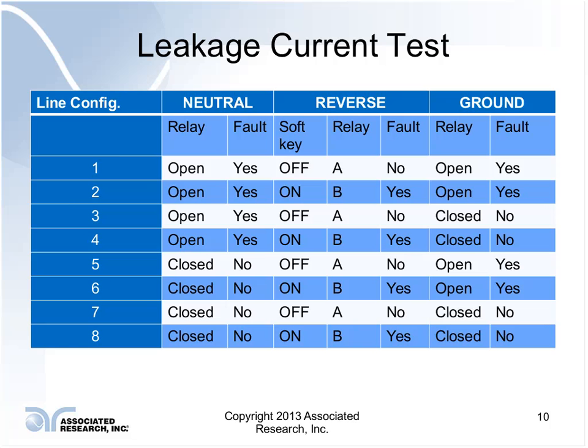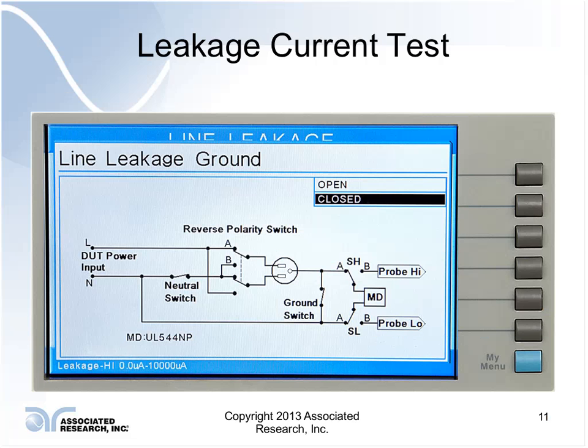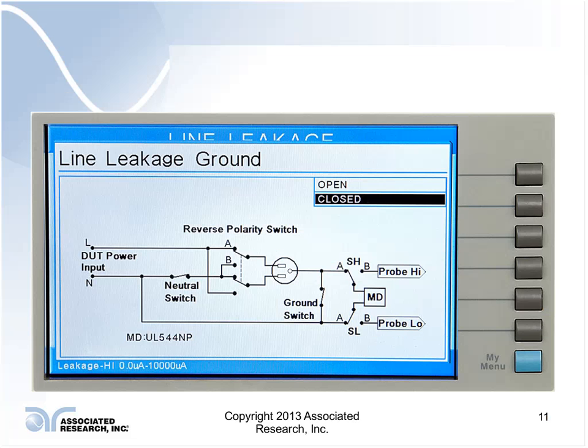It can't hurt to cover your bases, and if you do all 8 of these tests for every leakage test, you're pretty much covering your bases. You're going above and beyond what you need to do, which is never a bad thing. But you might see certain setups, certain labs, or customers test them with slightly less conditions, and that's okay, just as long as the main ones are covered. Now, let's take a quick look at what's going on here.